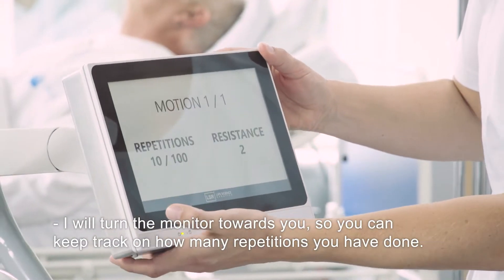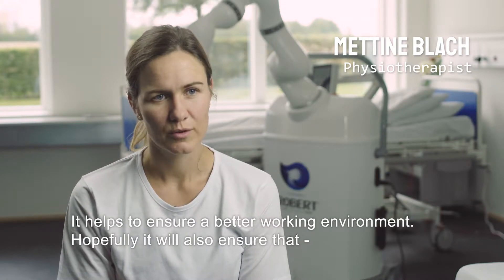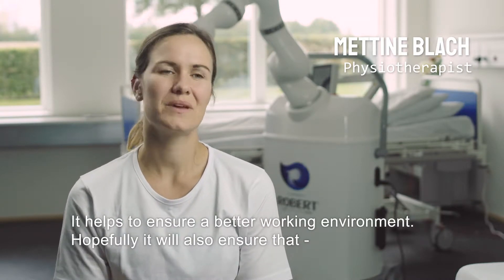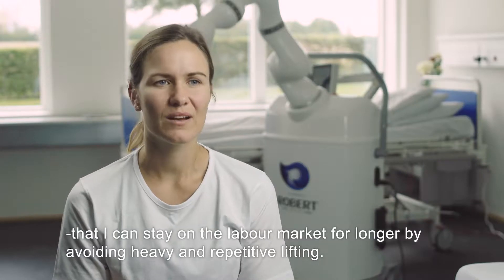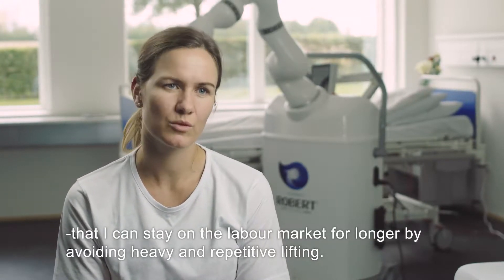You'll have a screen so you can follow up on how many repetitions you've done. It's going to ensure a better job environment. It's hopefully going to ensure that I can stay longer on the job market, as I'm getting rid of this tough repetitive movement.